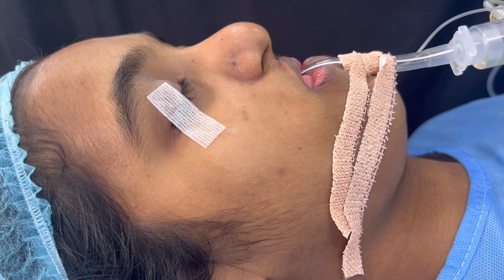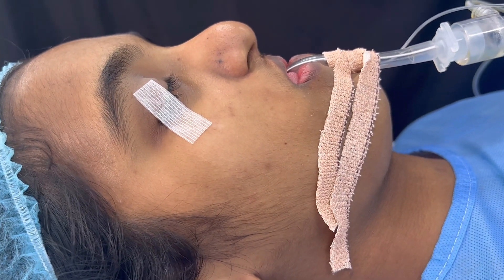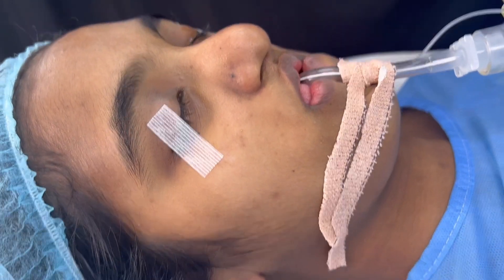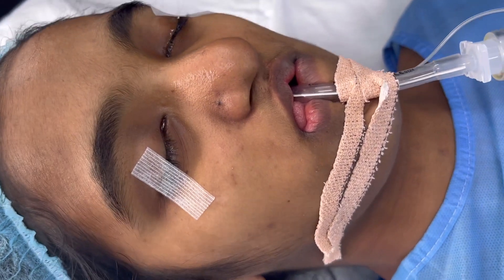We are about to start this underbite correction. We are going to do an upper jaw distraction. Distraction osteogenesis is a procedure wherein we create new bone. We are going to grow her bone on the upper jaw by 13mm — that's the plan.